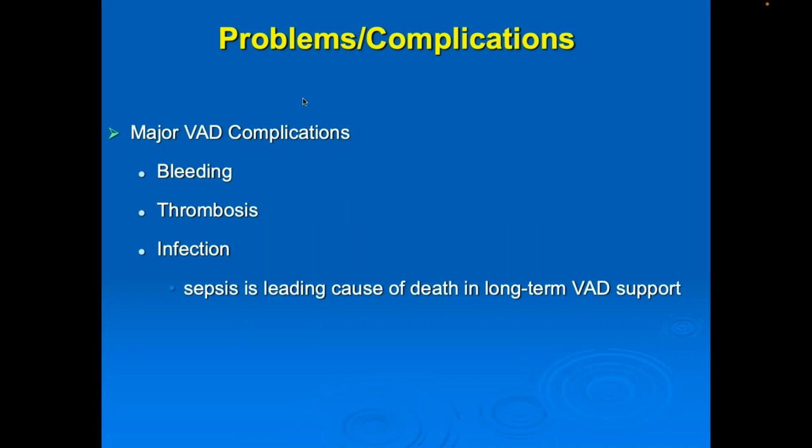Some VAD issues. Obviously, major VAD complications would be bleeding, thrombosis, and infection. Remember that sepsis is the leading cause of death in long-term VAD support, so please be familiar with sepsis indicators.